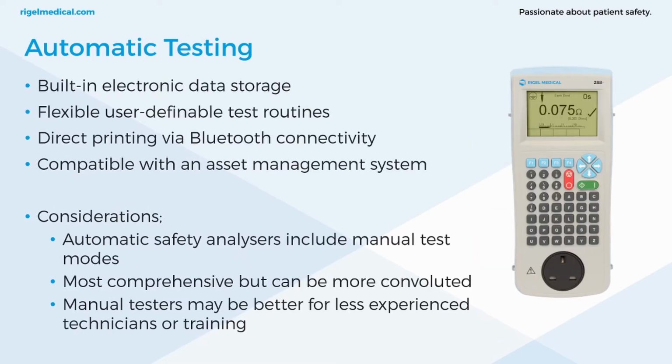However, automatic testers are often needed. This is because they have built-in electronic data storage, flexible user-definable test routines, so automatic test sequences, direct printing via Bluetooth connectivity, so your pass-fail labels, most commonly used, printed. You can also print results. Also compatibility with an asset management system.